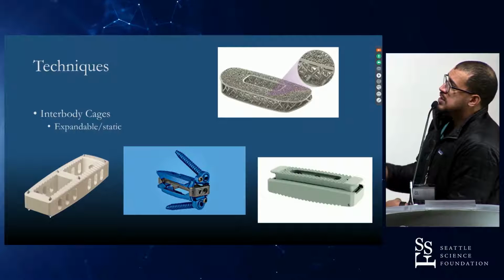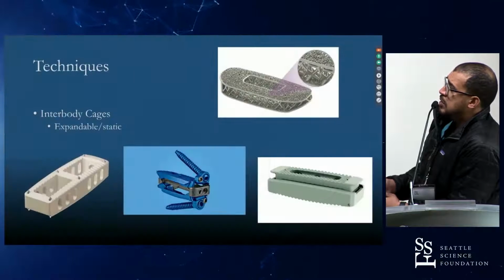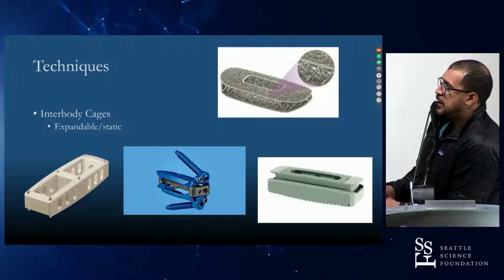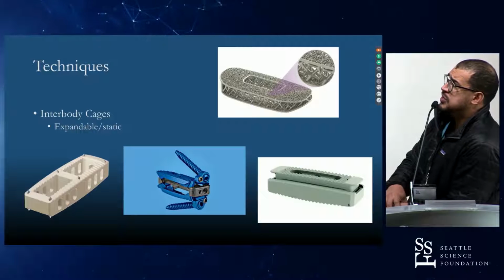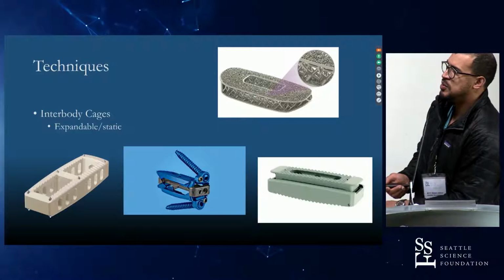And we talk about anterior column realignment. We also have some of these lordotic cages above, or expandable cages here. This is more of a square type. This is a lordotic expandable. So kind of all combinations, the very popular technique now with vendors to try to say, oh, this is the best. We can get into materials a little bit later if we want to have that discussion.